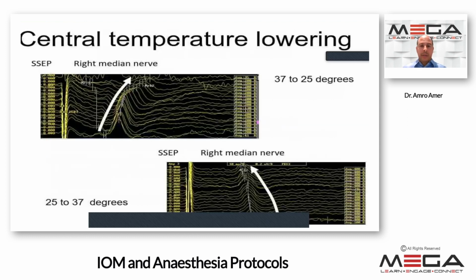Another way of showing the temperature effect. On the top, you can see the sensory signal, the latency is increasing with the hypothermia. On the bottom, you can see that with increasing the temperature, again, the signal is coming back to the left, back to where it was.